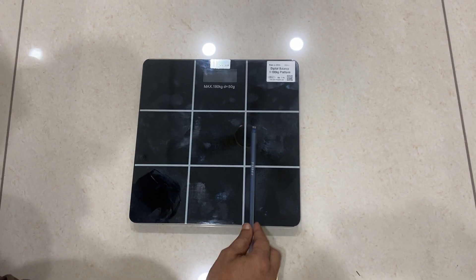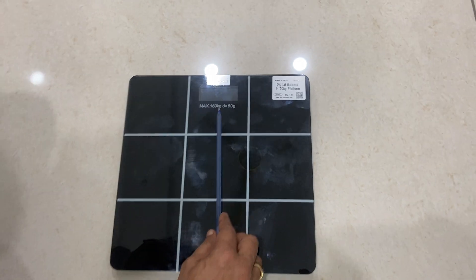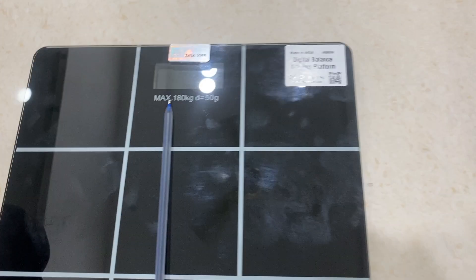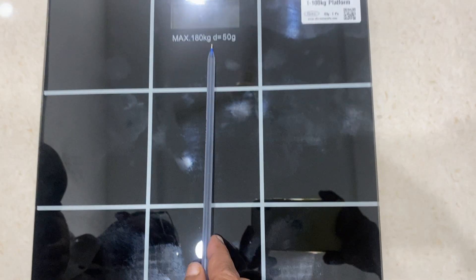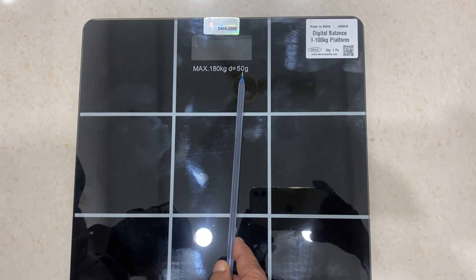This is a video by Avron, which is for the digital platform balance, or you can say this is also a personal balance, which has a maximum capacity of 180 kg and least count of 50 grams.